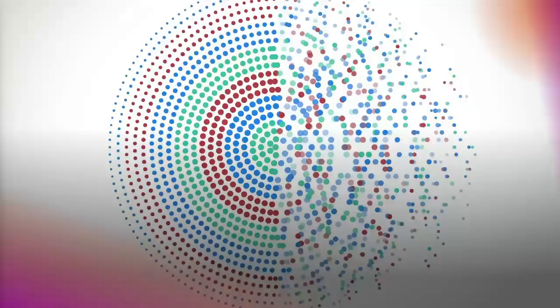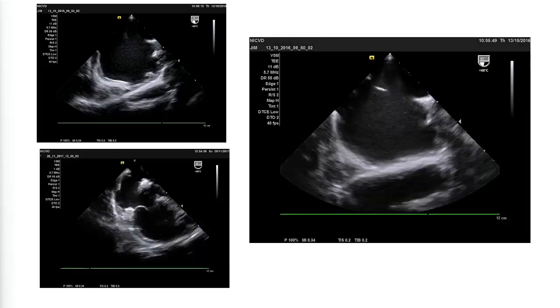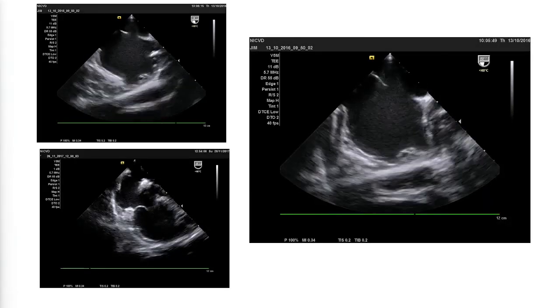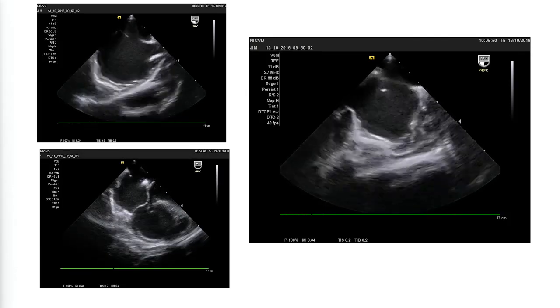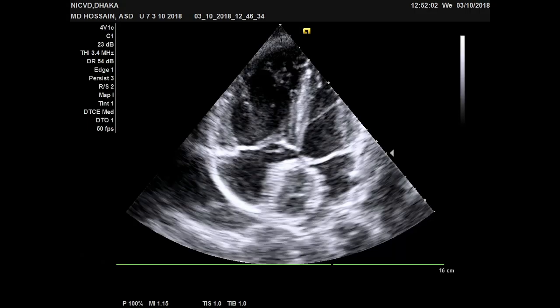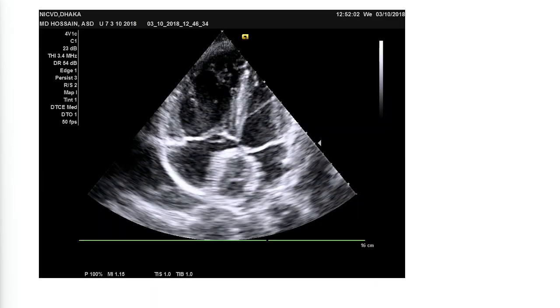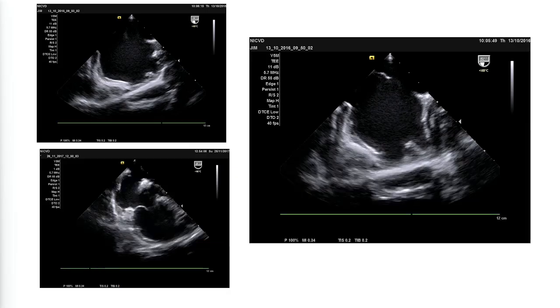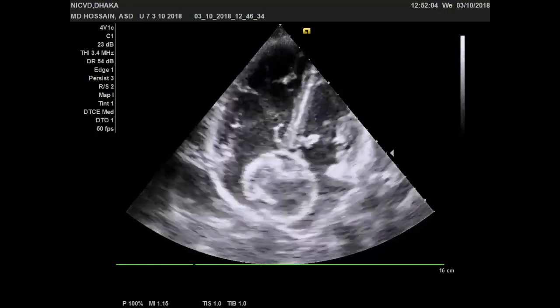Some difficulties can be overcome. When the rims are floppy — these are extremely floppy rims in both posterior superior, posterior inferior, and the IVC rim is floppy — we failed, and the device slipped down. This is the slippage of the device.